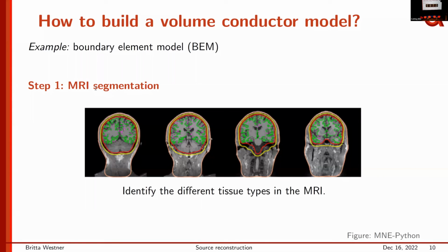The first is basic. Do we need fMRI and EEG or MEG to do that inverse problem? Yes. Not fMRI, but a structural MRI. Structural. So yes, okay. But we need this from the subject. It's not that I have EEG data and I can use a standard MRI and try to reconstruct something. Can I do that?